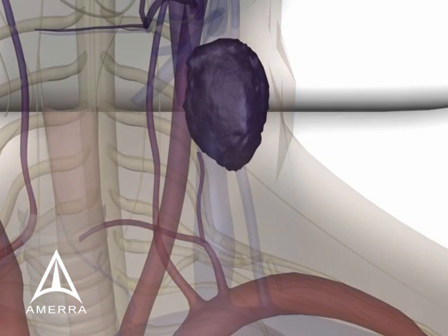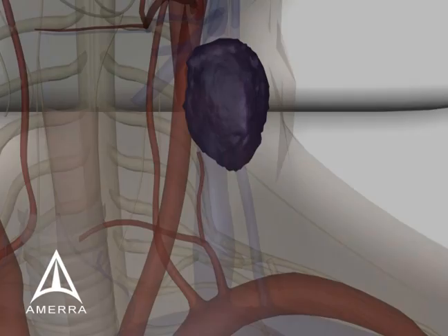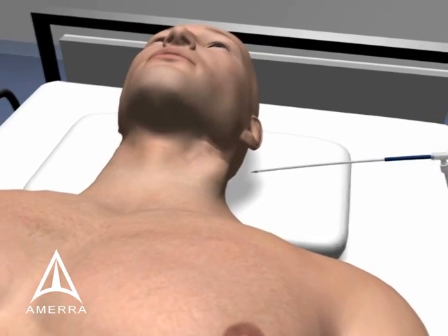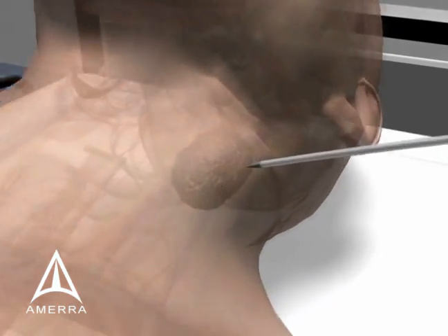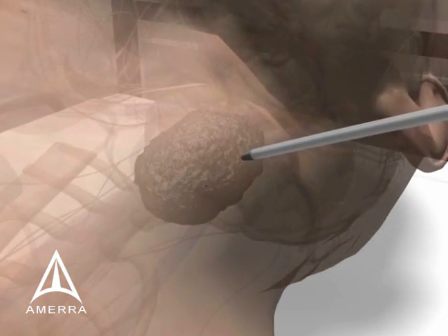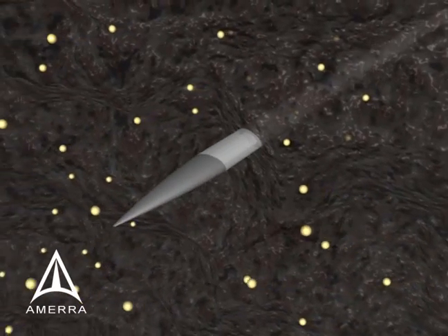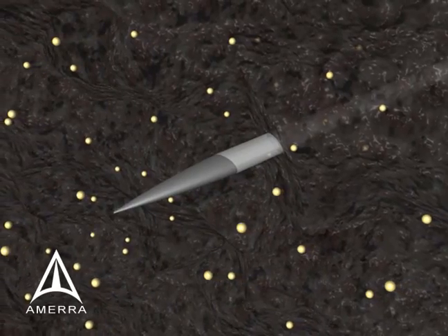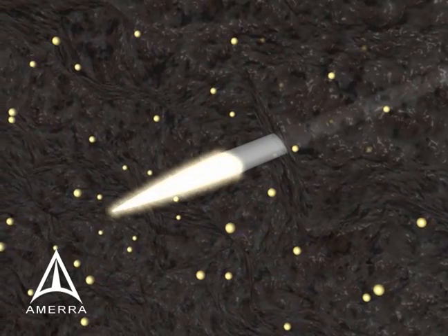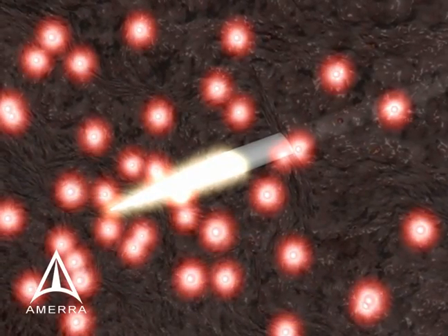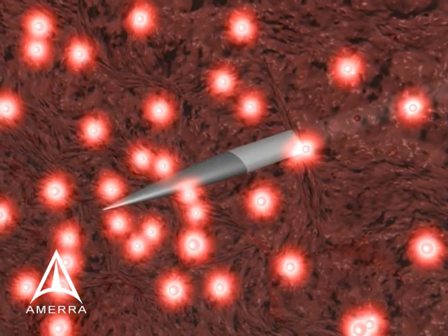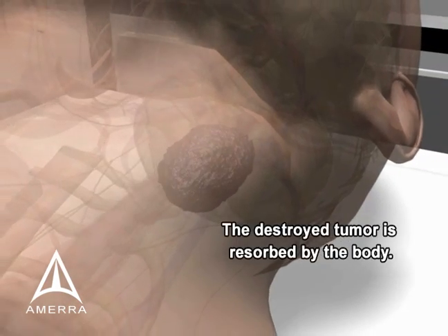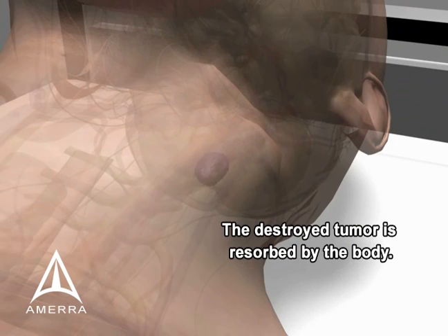After the particle infusion, the final step of the therapy is applied. A laser fiber is inserted through the skin near or into the tumor, and laser energy is applied in one or more illuminations. Particles absorb the laser energy and convert it to heat, resulting in the temperature rising to a level sufficient to destroy the tumor. The tumor will subsequently shrink.